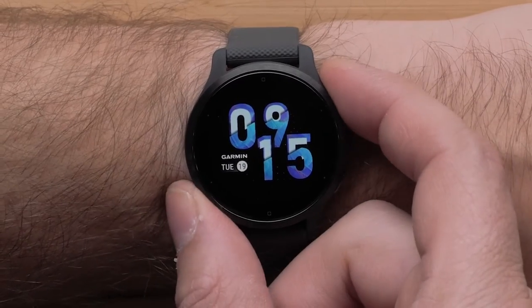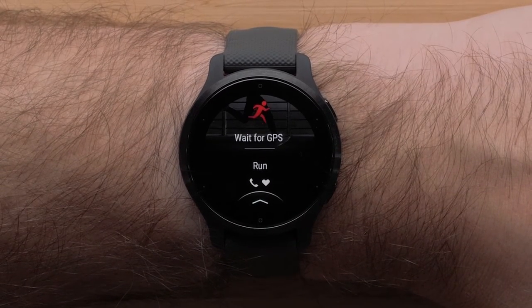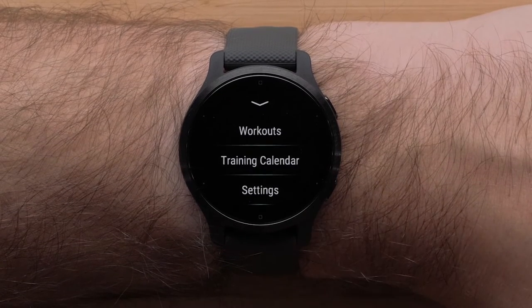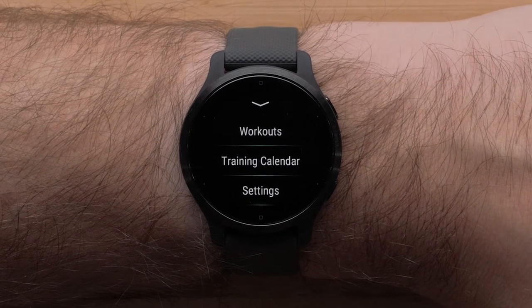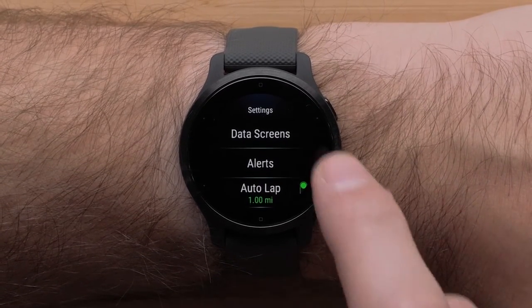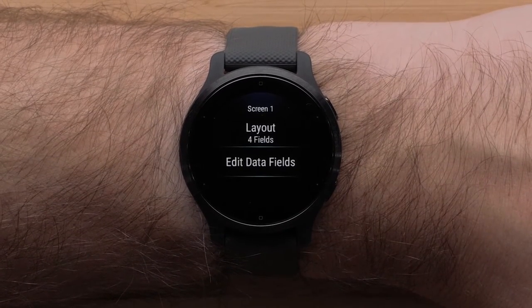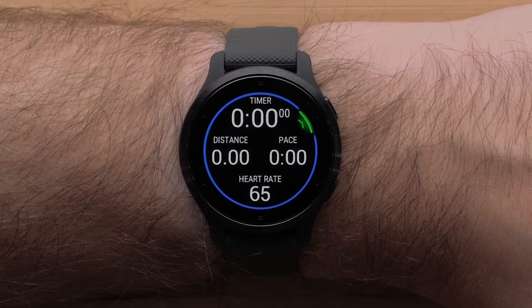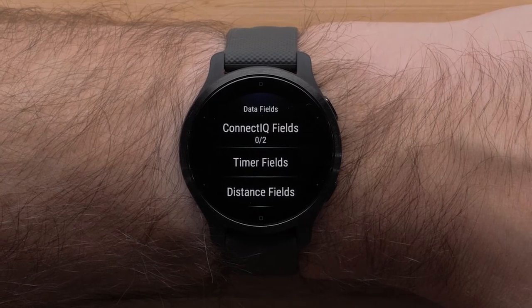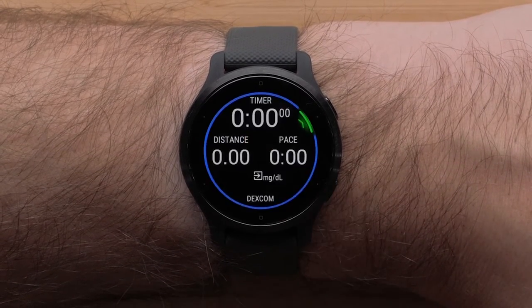Begin by pressing the Start button. Touch an activity profile that you would like to customize. For this video, we will be using the run profile. Swipe up from the bottom to access the activity profile settings, then touch Settings. Next, touch Data Screens. Touch a screen to customize. Touch Edit Data Fields, then touch a field to customize. From the data field category list, touch Connect IQ fields, then touch Dexcom data field.